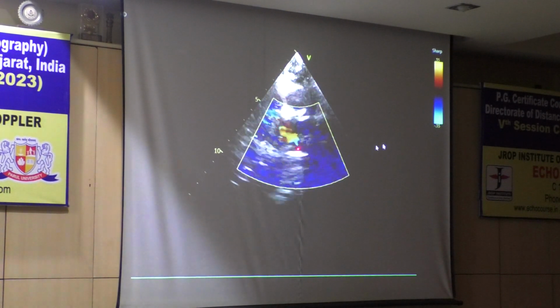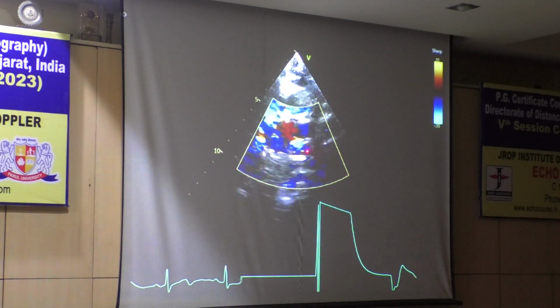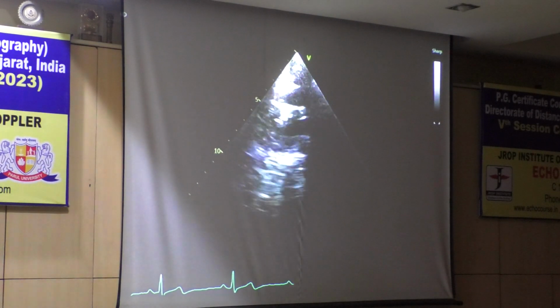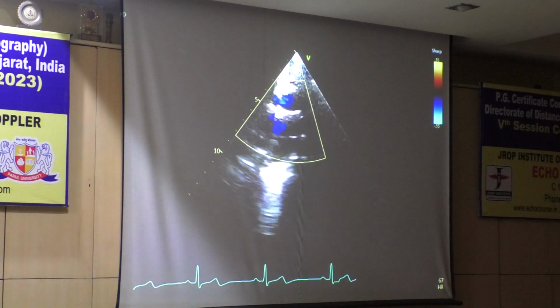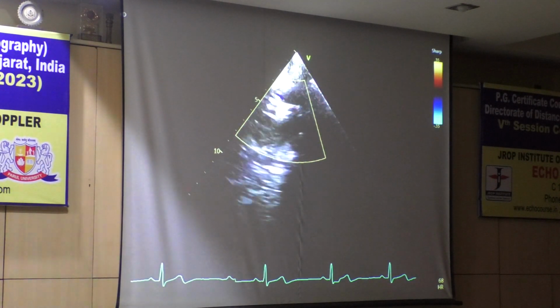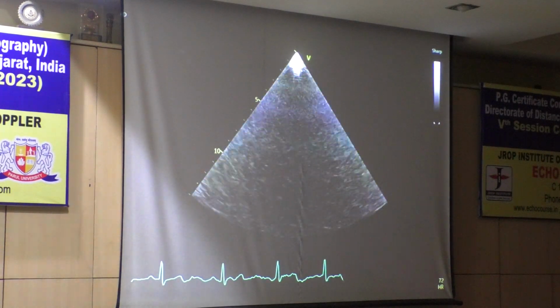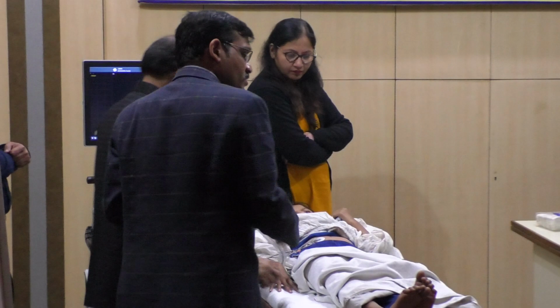So this is the left lower vein, left upper and right side vein. So in a smaller child, the crab view will be very good. In a bigger child, this may be difficult. But you can still see the left side vein very well in the crab view. Is that okay? And I will go into the details further when we have smaller kids.